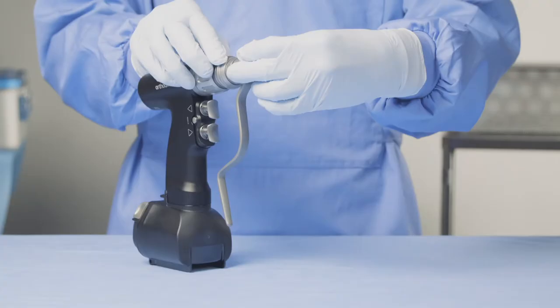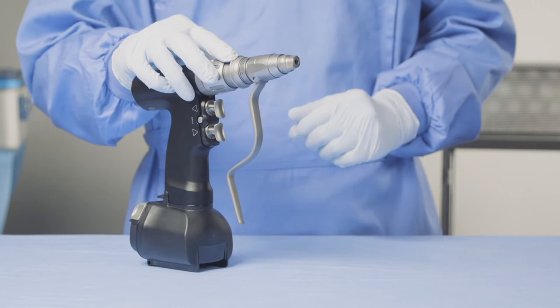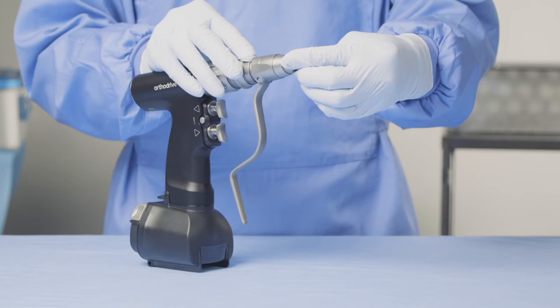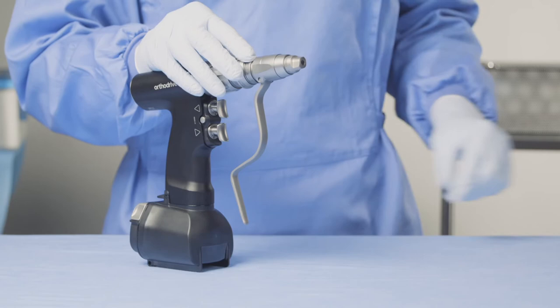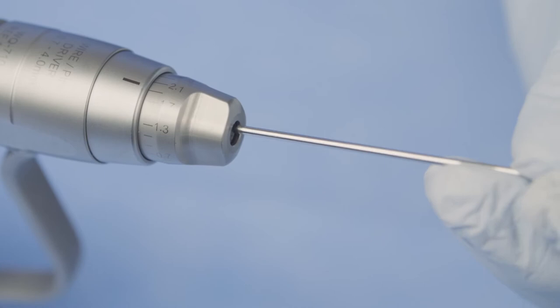Now, here we have the WQ710 attachment. This is a fully adjustable wire driver that allows you to insert wires from 0.7 to 4 millimeters in diameter. You can do this by simply pushing in the nose of the tool and dialing in to the correct number. I'm going to be using a 1.8 millimeter K wire, so I will set it to the 1.8 millimeter position. You can then take a K wire, such as this one, and slide it in through the cannulation, like so.